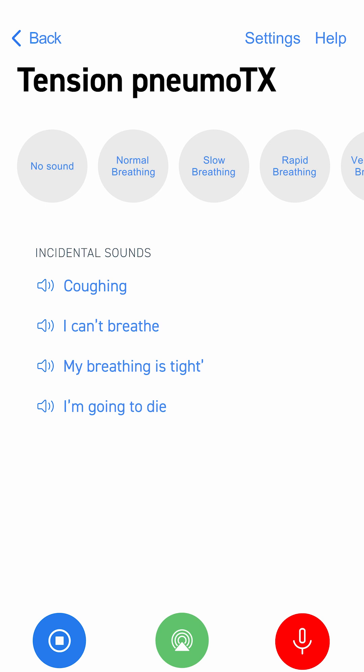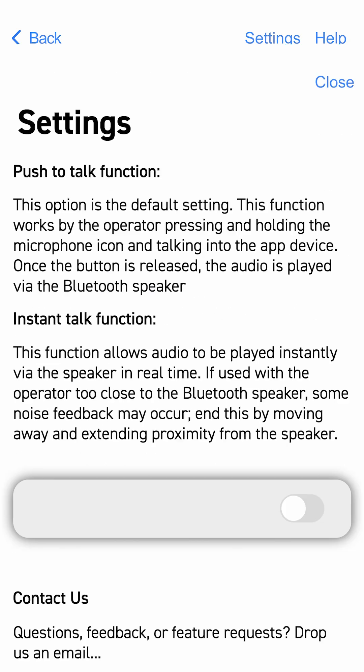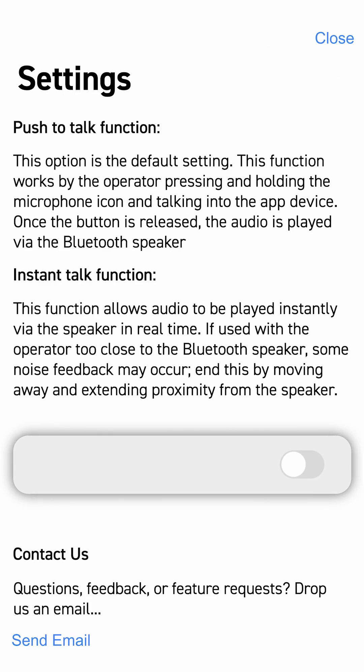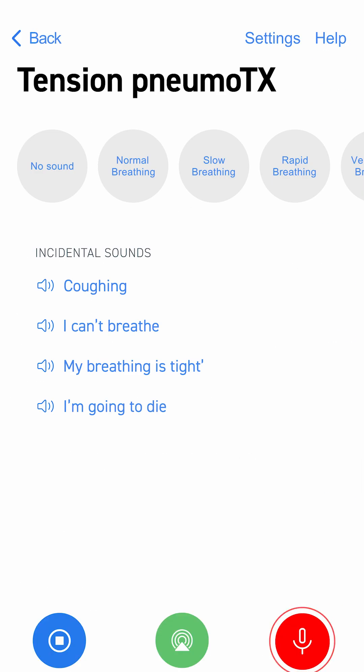Please note that the push-to-talk function records live audio when you press and hold, and plays it when you release the button. You can also play real-time audio by using the instant talk function. Please be aware that the instant talk function may cause unwanted audio feedback when in close proximity to the Bluetooth speaker.